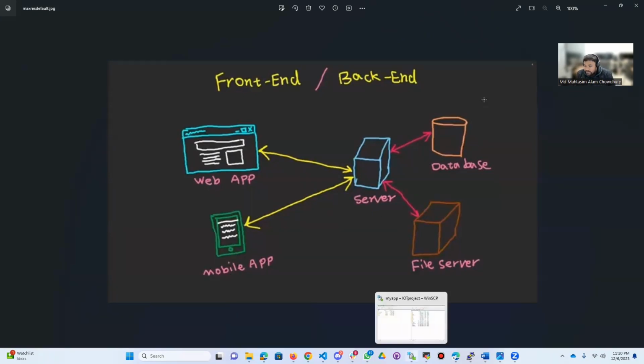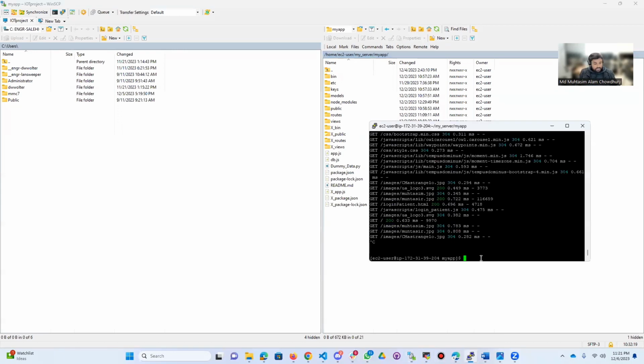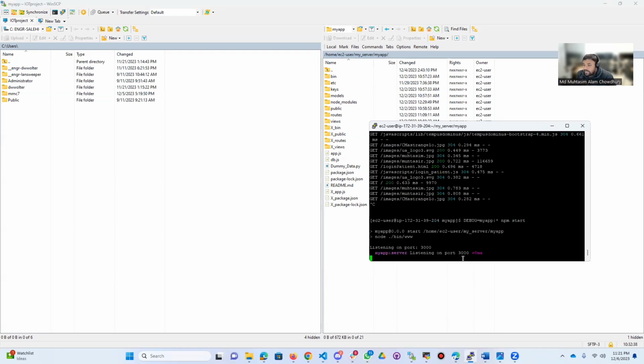Moving to the project, let's first start with the server side. We are using WinSCP and PuTTY. You can see here, if I insert my command to start the server, let me copy it. I guess it is somewhere here. Okay, I get it. And you can see the port 3000, that means the server has started running.